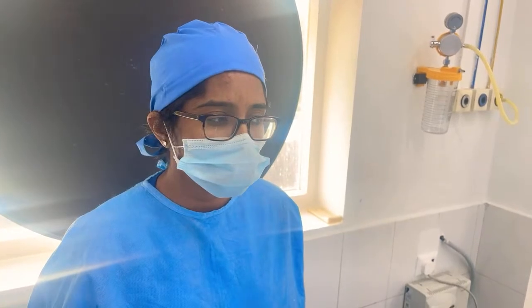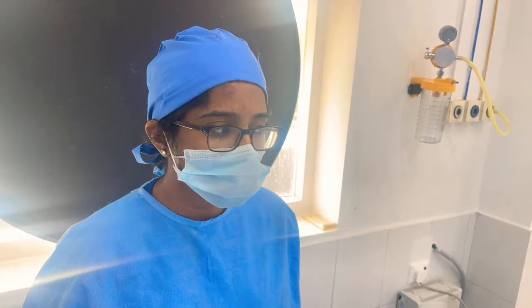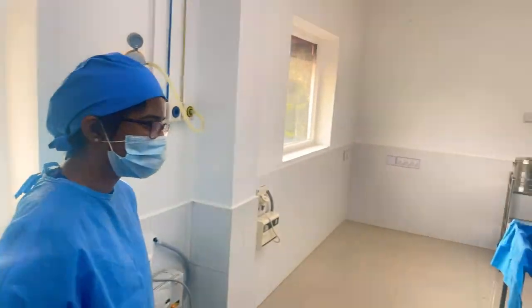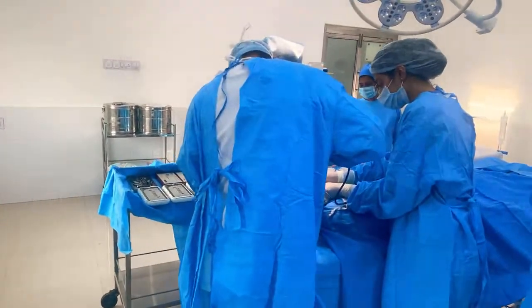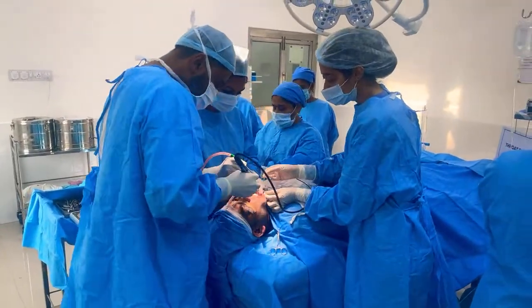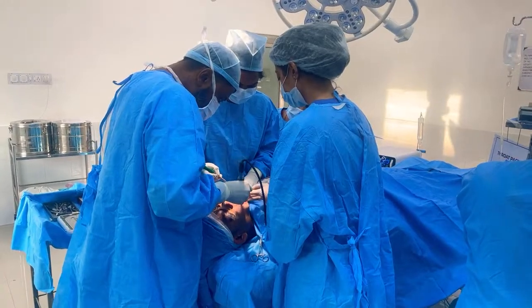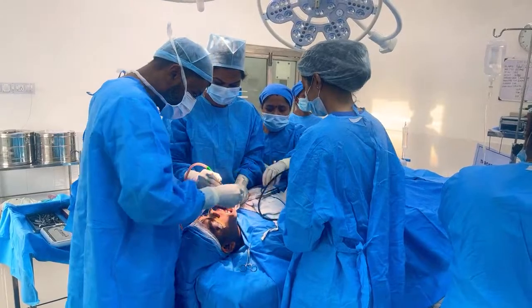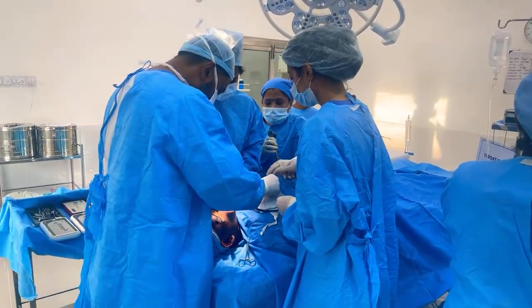Initially you will face a little difficulty as a surgeon to use it, but once you're experienced enough, it just makes your life easier. That's the osteotome I showed you earlier.